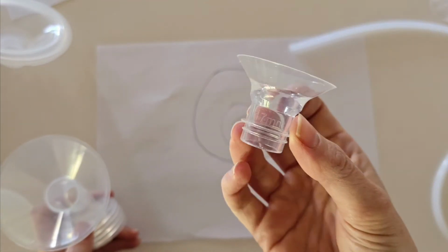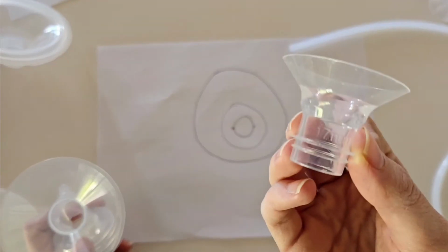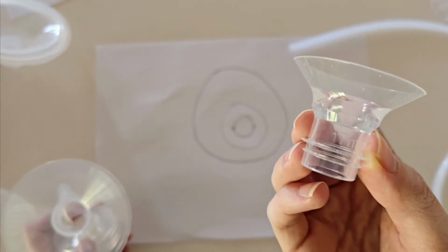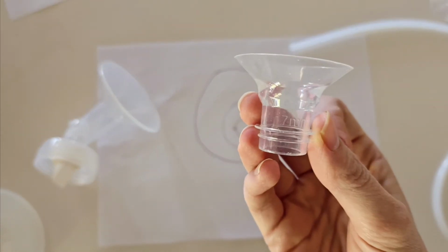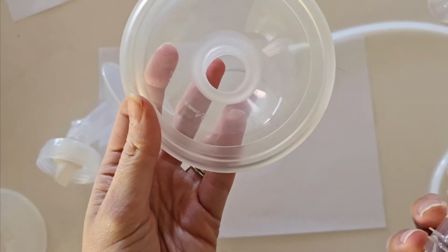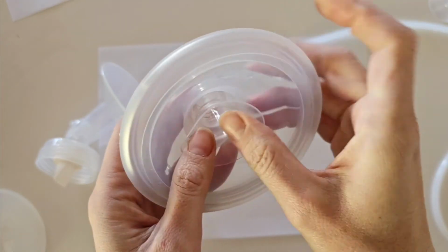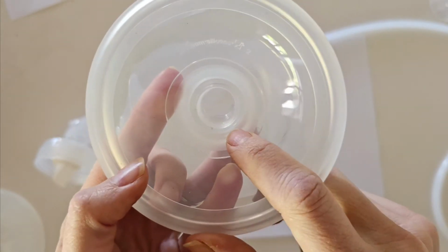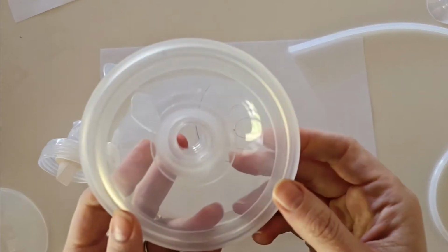you are going to want to use what is called a flange insert. Now, these are specific to your pump model and brand, so make sure when you are purchasing your flange inserts that it is compatible with the flange of your breast pump. So this is a Mum Cozy compatible flange insert. If I were to grab my 24, it says it on here, 24 millimeter flange, I simply grab my insert and slide it in. Now that then reduces the size of the tunnel to a 17 millimeter, which then will be ideal for my nipple size. And then you go on and you can use your pump as you normally will.